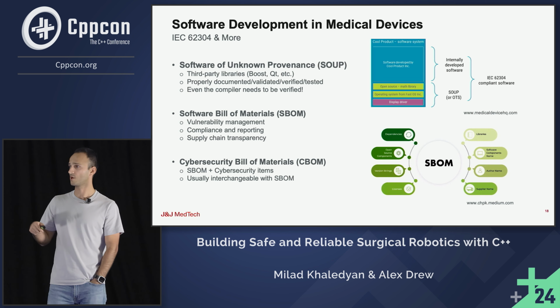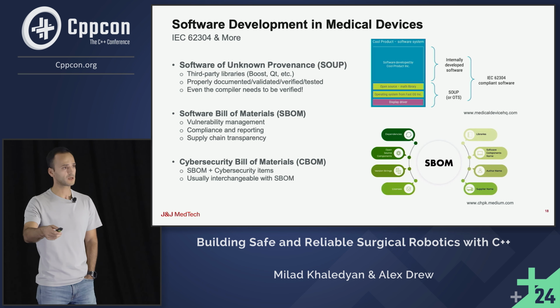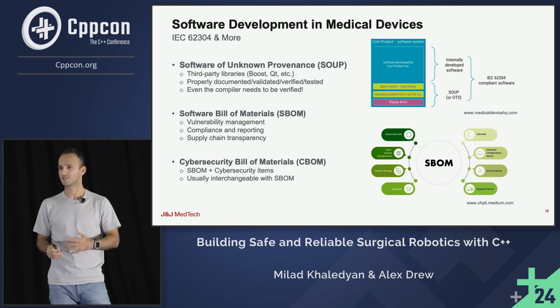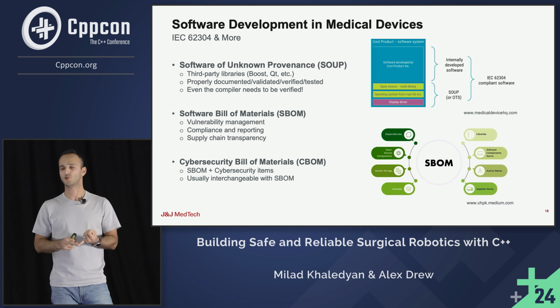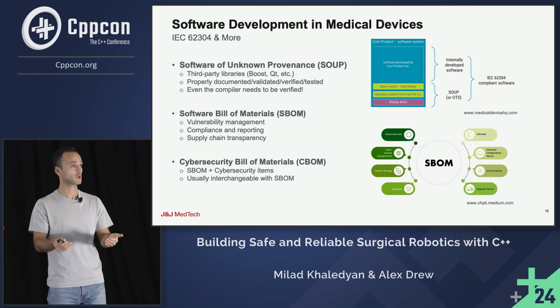Those two are pretty much interchangeable, so we can use them interchangeably. SBOM is basically the software bill of materials, and you have to generate a giant document and submit it to the FDA that has all the software items you use, including their version, their author, their supply chain transparency. Basically everything about that software has to be documented properly.